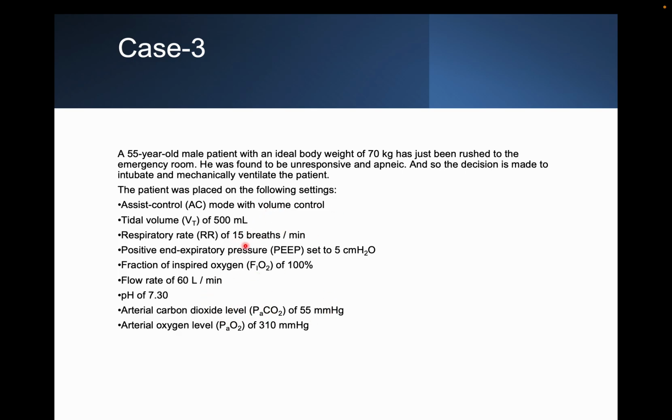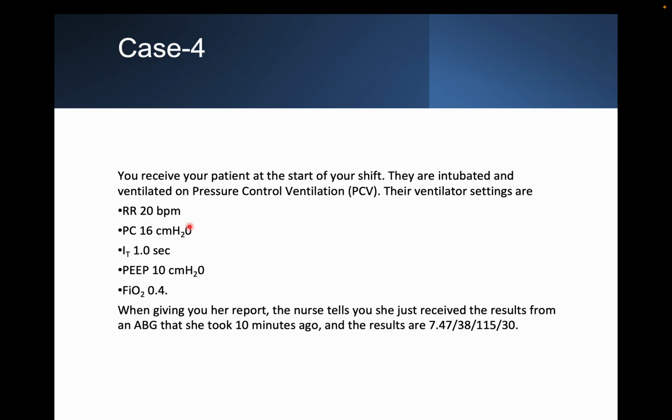But while you increase the respiratory rate and tidal volume, always keep auto PEEP in mind. Next is auto PEEP; I will tell you what auto PEEP is. So in this patient, you decrease the FiO2 mainly, then decrease the PEEP, then increase the tidal volume and respiratory rate.